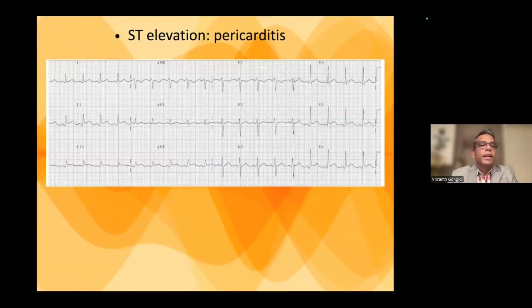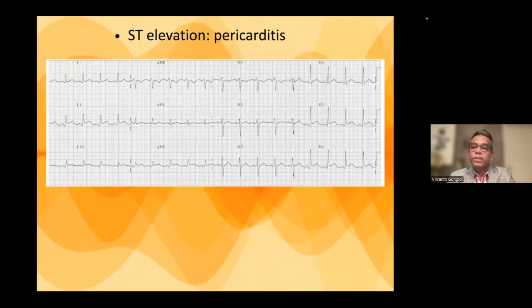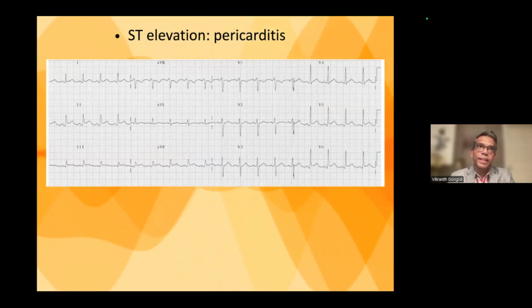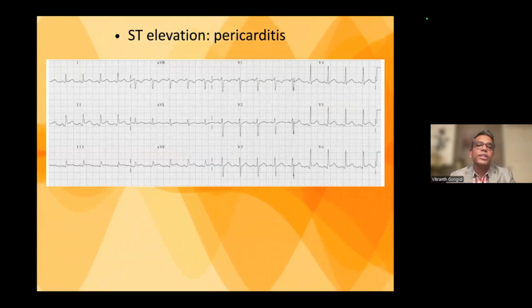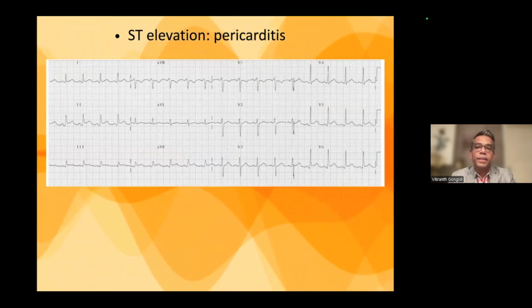okay. Everybody for some reason thinks that the baseline of an EKG is the PR interval. It actually isn't. The most isoelectric point is the TP segment. That's when there's no electric activity going on, and that's why it's isoelectric. The signals are equally balanced. So the TP segment is the baseline. And so the PR interval is supposed to be around the same level as the TP segment.